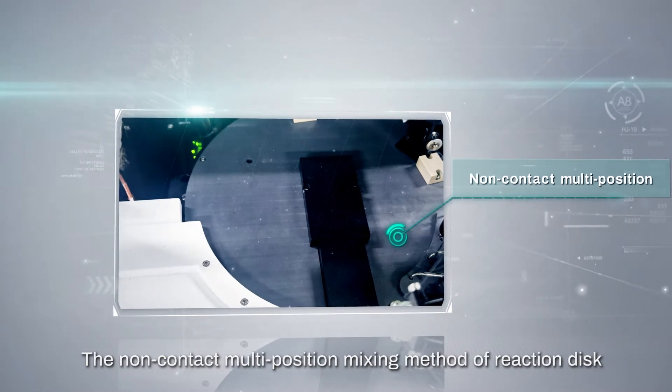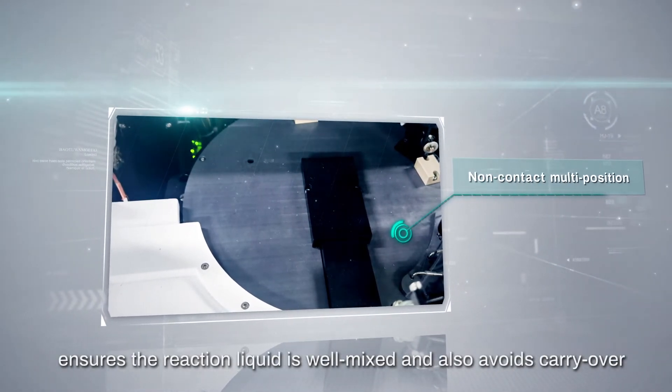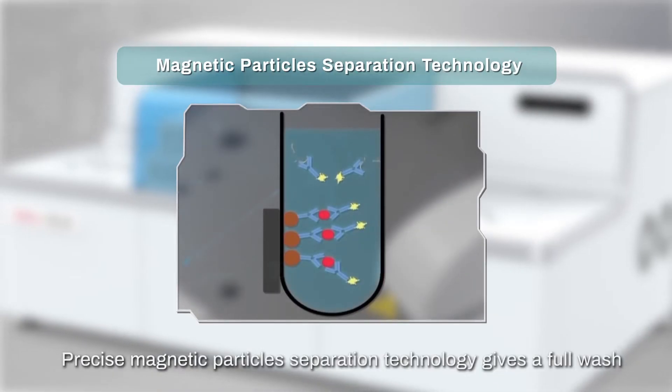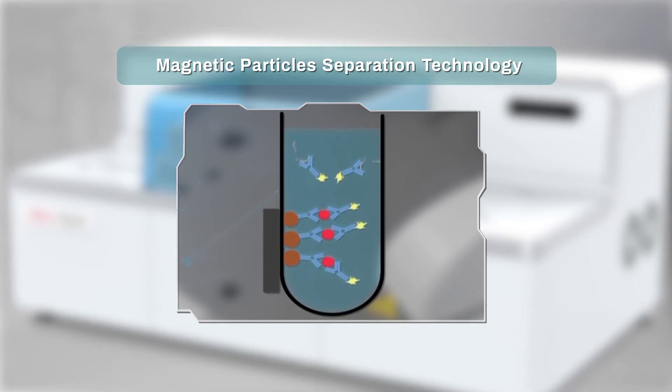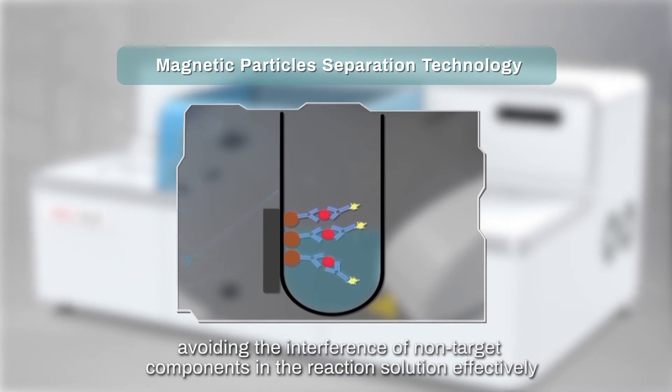The non-contact multi-position mixing method of the reaction disk ensures the reaction liquid is well mixed and also avoids carryover. Precise magnetic particle separation technology gives a full wash, avoiding the interference of non-target components in the reaction solution effectively.